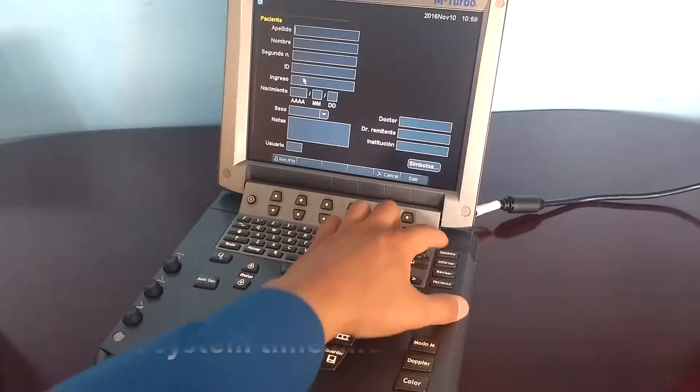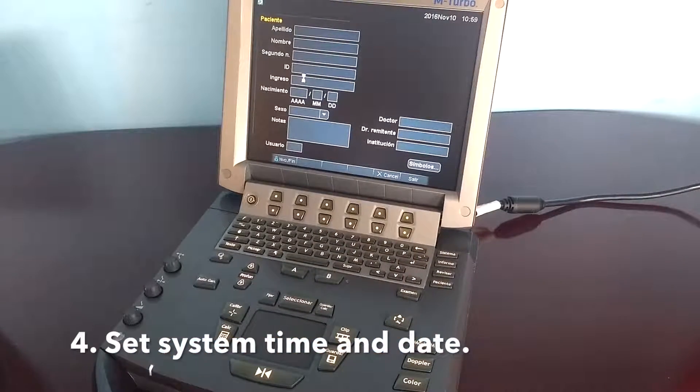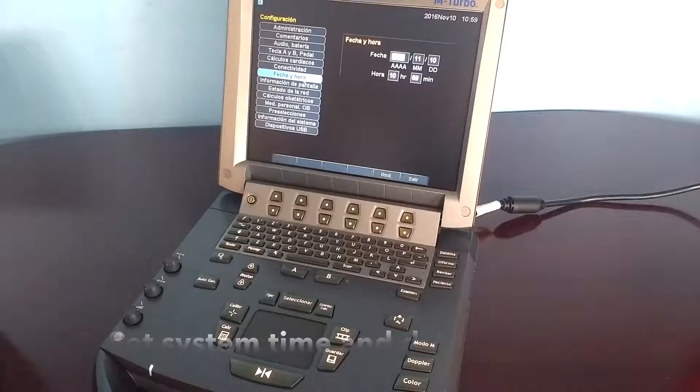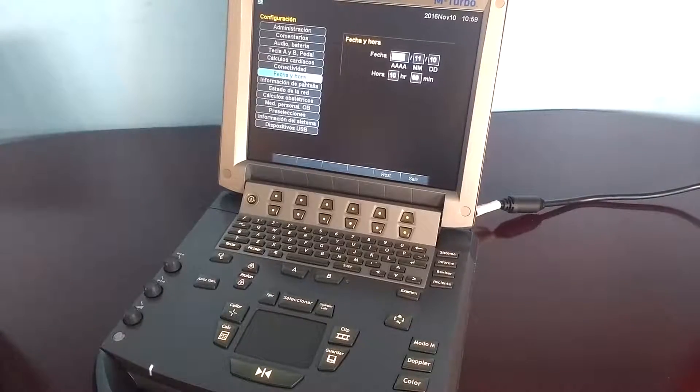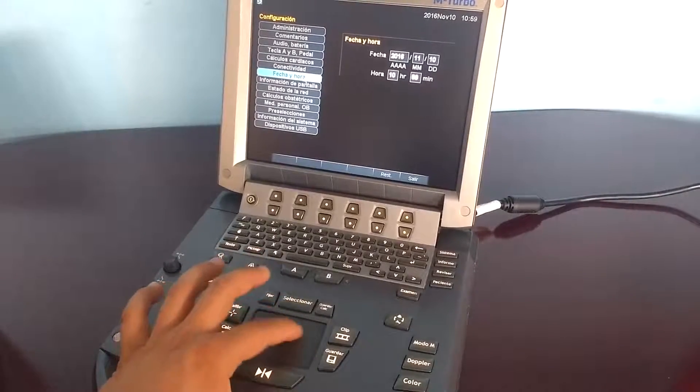Check the system time and date by pressing the system key and clicking on time and date.